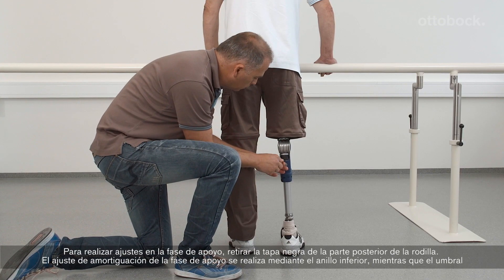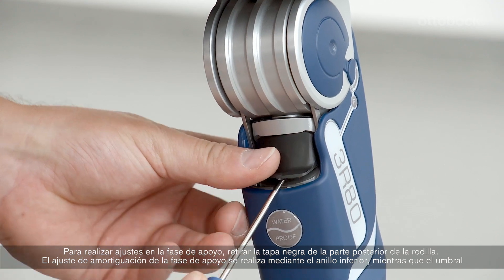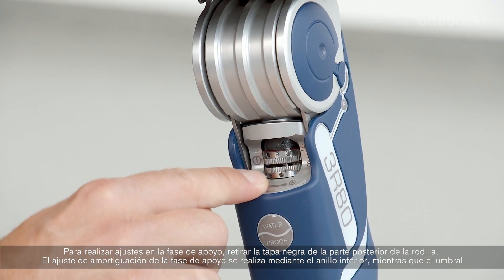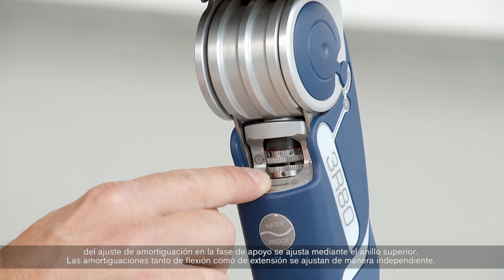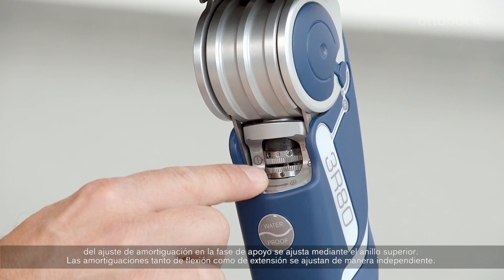To make adjustments to the stance phase, remove the black cap from the back of the knee. The stance phase damping setting is adjusted by the lower ring, while the stance phase damping threshold setting is adjusted by the upper ring.